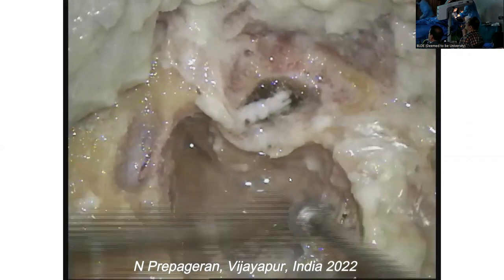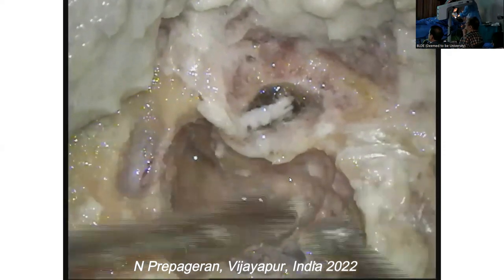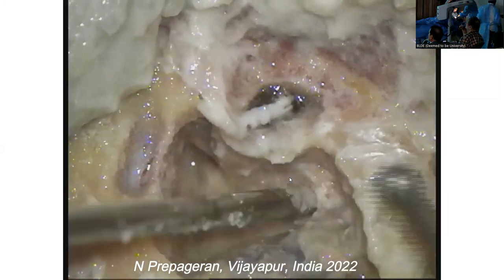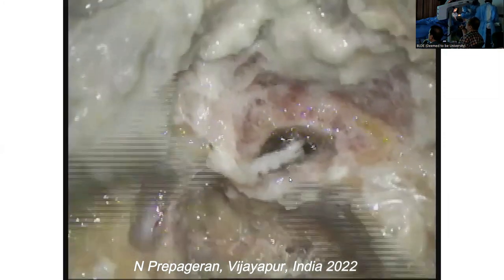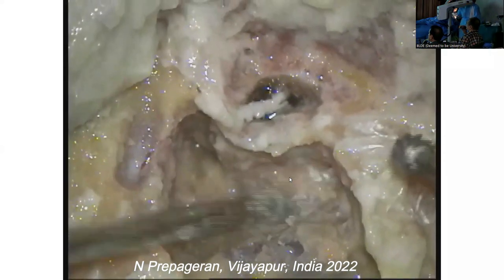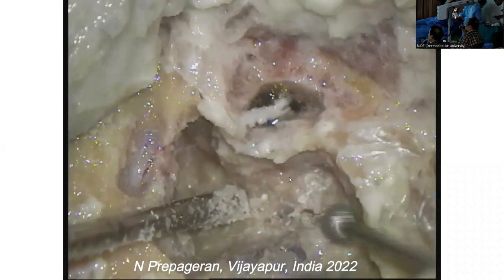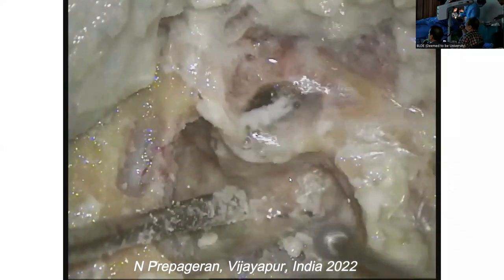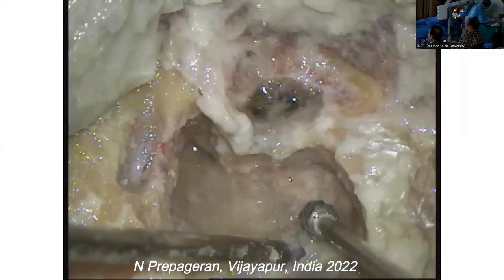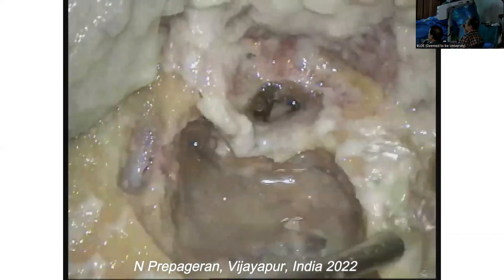And then follow it down to the mastoid tip. You can see how the drill is wobbly. So this is what you don't do in skull base. Now push the sigmoid sinus down. You get a shelf of bone, then you can drill quite easily.